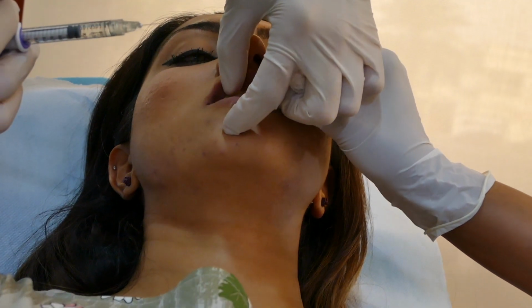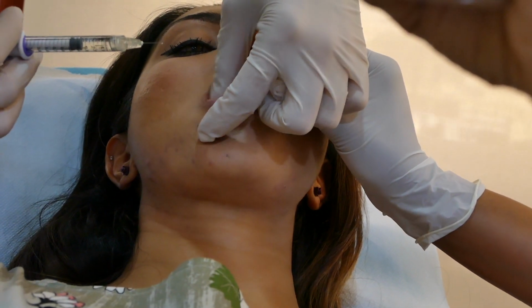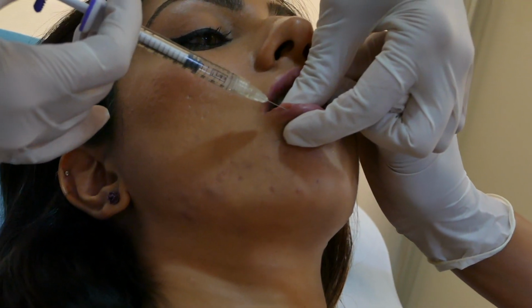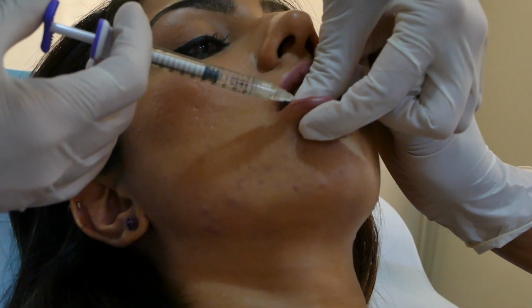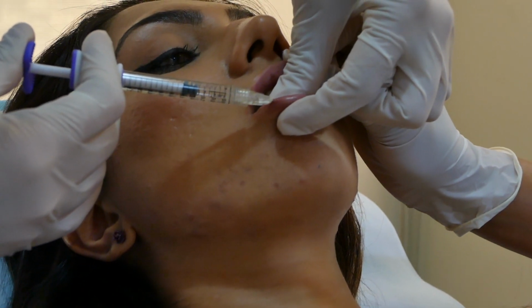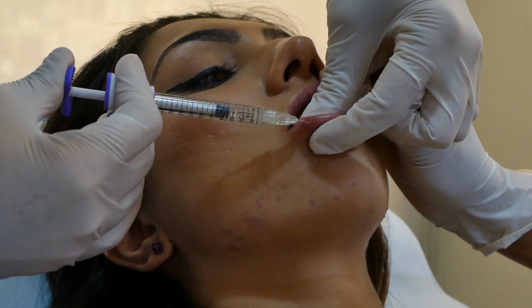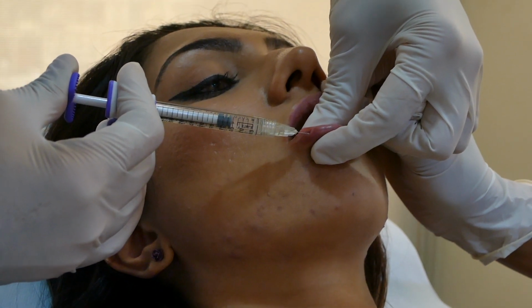Then the lower lip is injected using the same manual by pinching the lip between thumb and index of left hand and injecting with the right hand, placing the needle into the muscular layer and injecting small quantities.